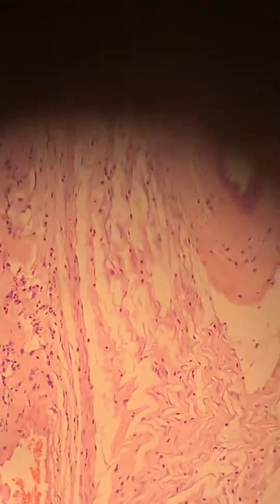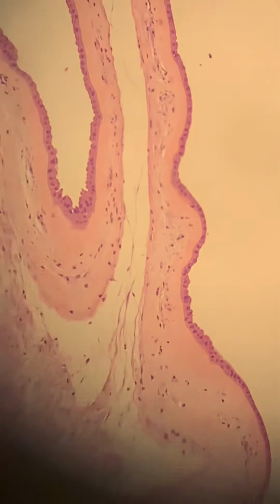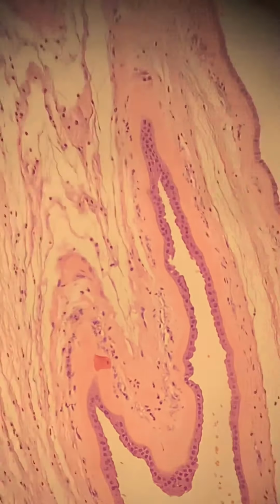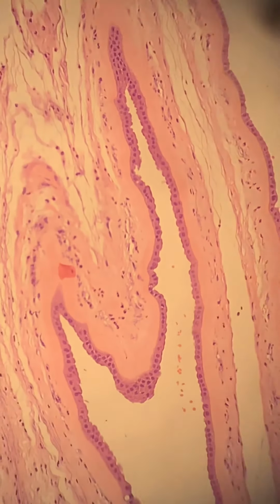All right, we're going to go to the fetal membranes now from twin B. So the fetal membranes from twin B show meconium histiocytosis and evidence of acute chorionitis, as I try to keep this thing still. But that's definitely real there. And you can see it there too. So that would be acute chorionitis and meconium histiocytosis.